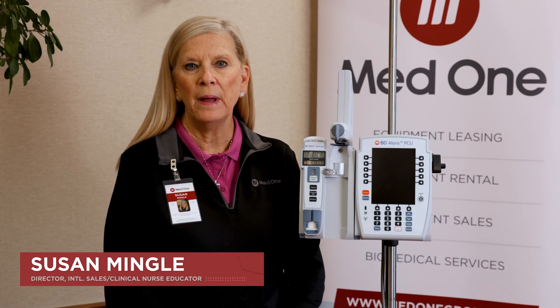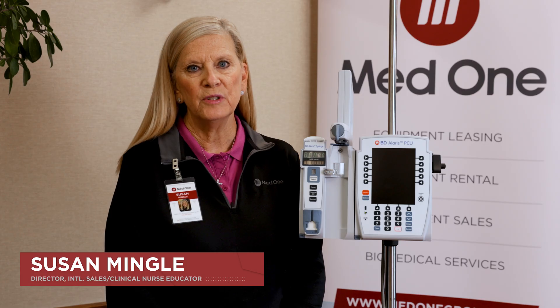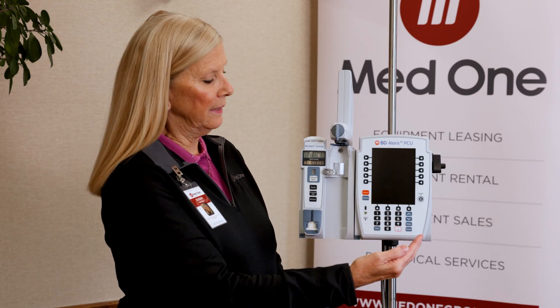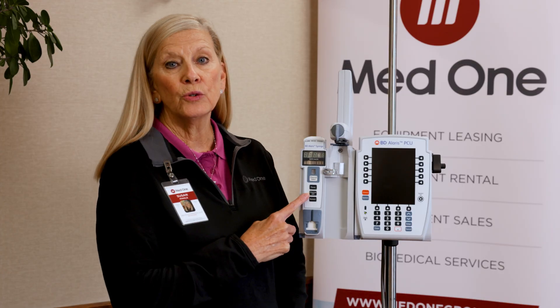Hello, my name is Susan Mingle. I'm a clinical nurse educator for MedOne Group. I'm here today to provide a demonstration on the BD Alaris PCU point-of-care unit and the BD Alaris syringe pump that will be used in settings such as clinical trials or drug studies. There is no drug library in this demonstration.